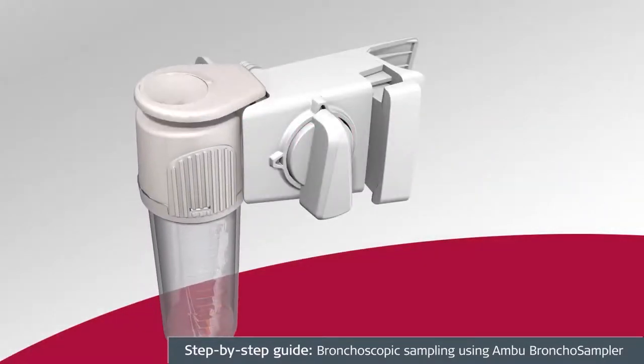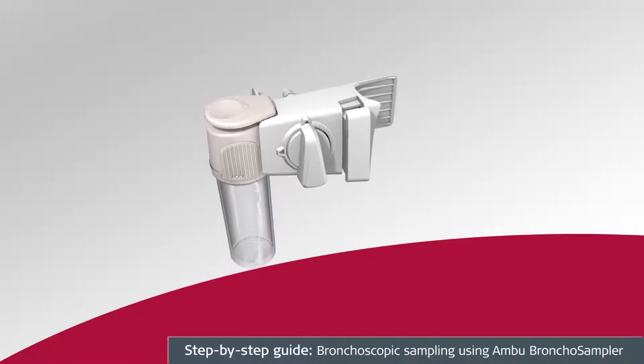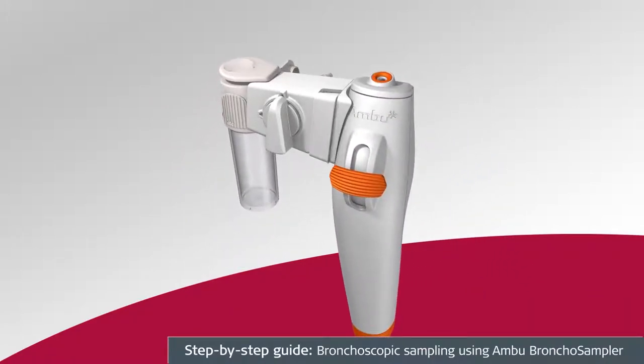The Ambu A-Scope Bronco Sampler is a sterile single-use device designed as an add-on to the A-Scope IV Bronco, used for the collection of fluid samples during bronchoalveolar lavage or bronchial wash procedures. The A-Scope Bronco Sampler works only with the A-Scope IV Bronco and provides a one-of-a-kind fully integrated closed-loop sampling system.